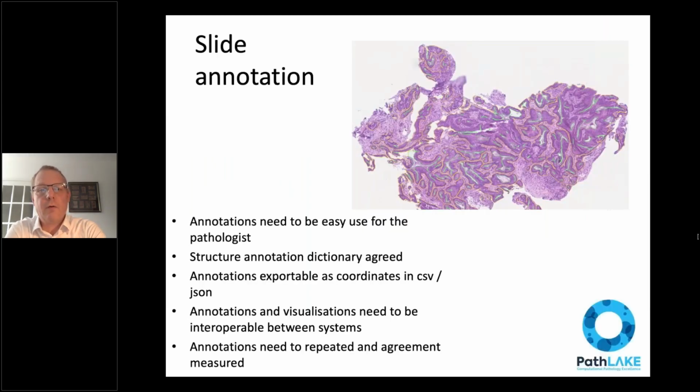These algorithms which we've been developing have required, to some extent, the provision of annotation. And I wanted to use this talk to explain a little bit about what it's been like as pathologists providing this ground truth data for our computational pathology colleagues to make use of in the computer engineering suite.